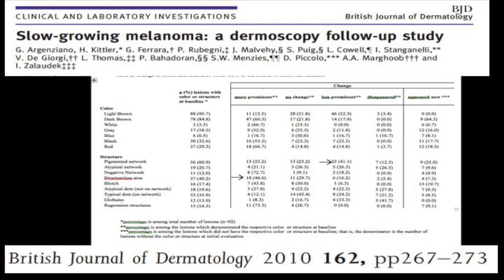There was an interesting study that was done a few years ago. The data actually makes more sense today than it did when we did the study. Basically, we went to all the high-risk centers, and we said, have you ever taken a picture of a melanoma with dermoscopy, but you thought it was benign, and then you didn't do anything about it for at least 1 year, and when you removed it, it was a melanoma, but it was a melanoma from day one as well, right? And so, yes, we were able to collect a bunch of melanomas. We call those the slow-growing melanomas, so that at some point after a 1-year period of follow-up, they were eventually removed and were indeed melanomas.